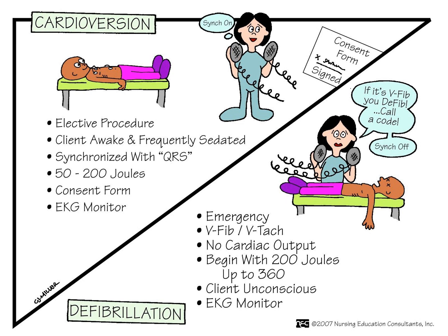Now, let's look at something that is called non-synchronized discharge of this energy. Okay. It would be defibrillation. It is not put on the sync mode to deliver this charge. Okay. We like to use defibrillation for VFib and VTAC, okay, because it requires higher levels of joules or energy to convert these rhythms. All right, so we already said the treatment for VFib is defib, so this is right in line with what we were saying.